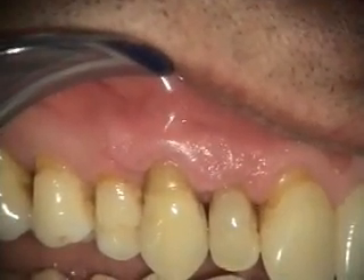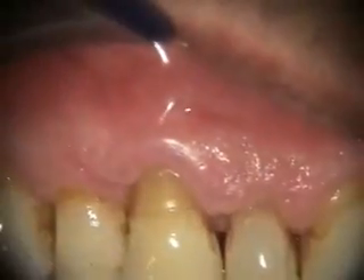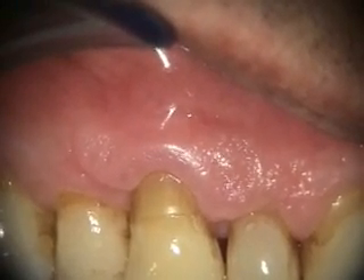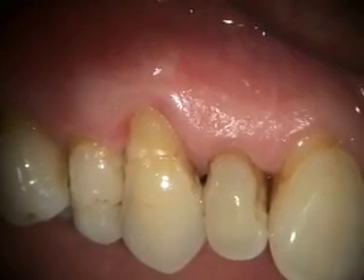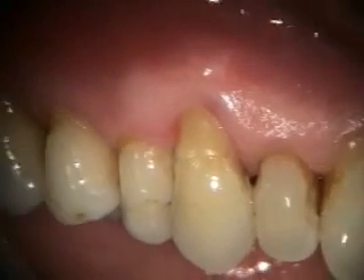So this is the two-week healing of the Geristore repair on tooth number six. We'll take a look at it with a little more magnification. And at this point we'll be taking a look at it in another couple of months. So this is the three-month healing of the Geristore treatment on that resorption on number six.